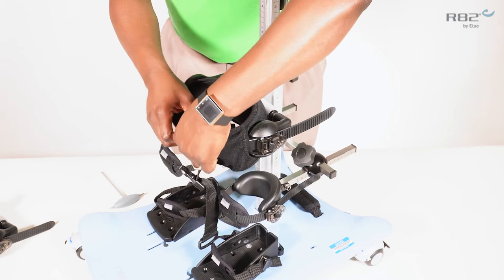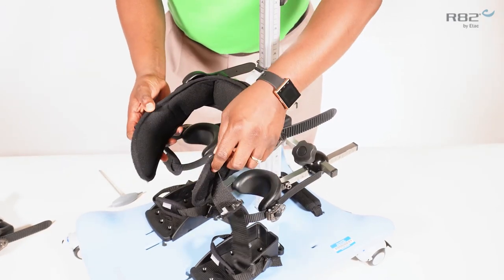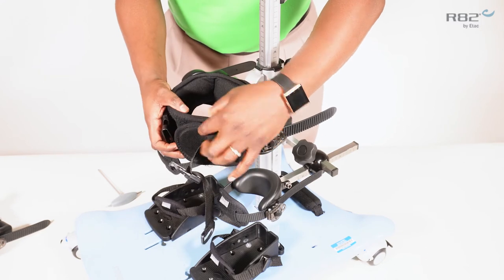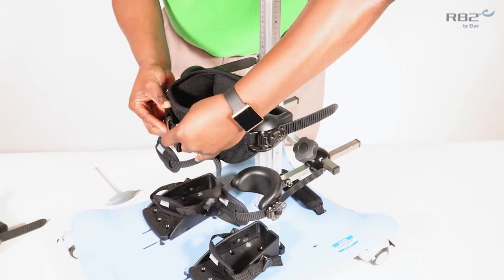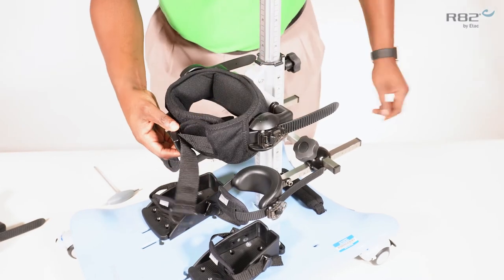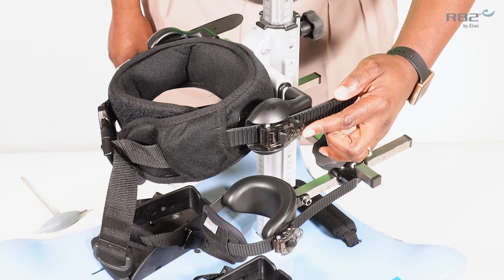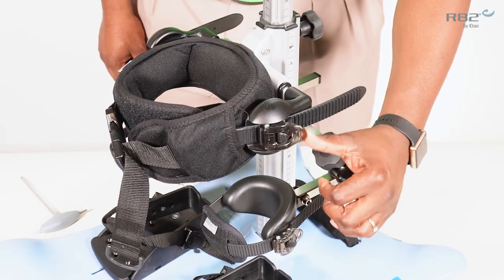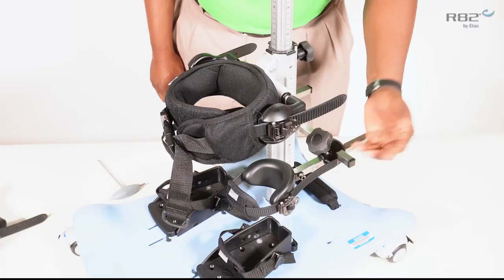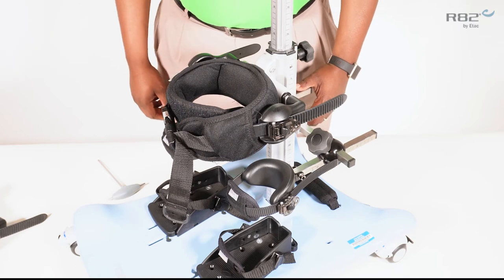The pelvic support will attach first with a velcro and second with a buckle. The pelvic support is equipped with a ratcheting system that will allow you to ratchet the pelvic support for derotation as well as a secure fit.